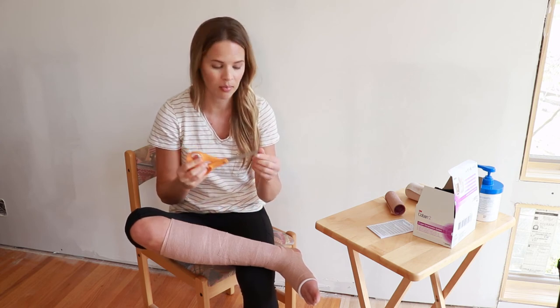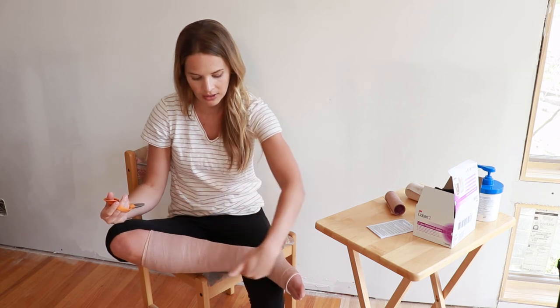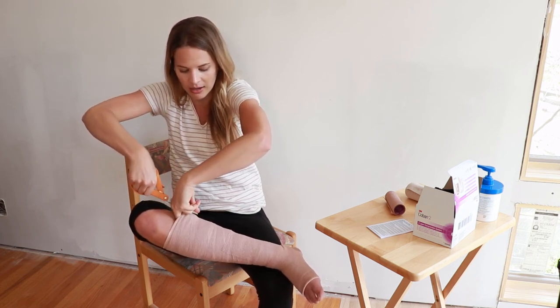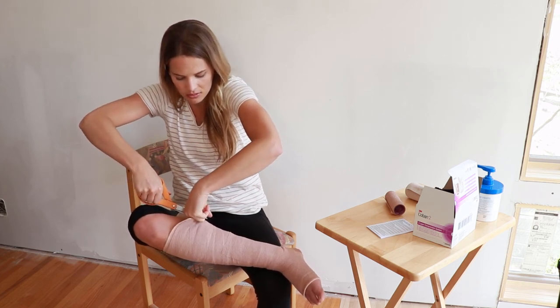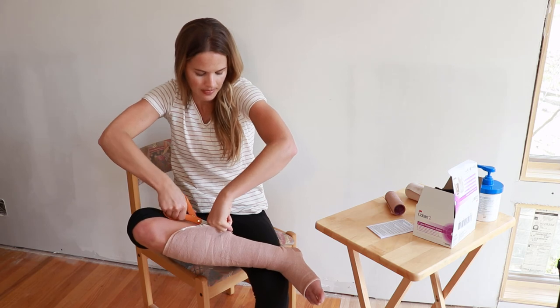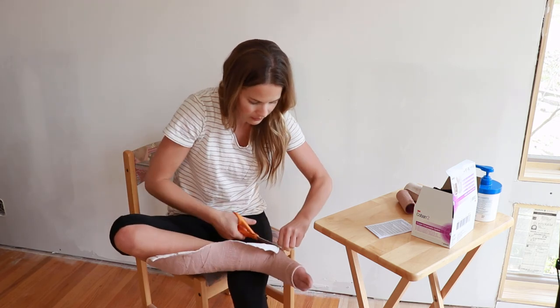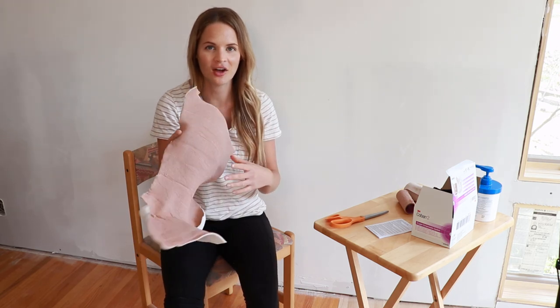You want to use blunt tip scissors so you don't get yourself cut. Cut on the side of the leg, not down the middle, so when you come down with your scissors you don't get yourself. Stick your fingers underneath and put the scissors on the other side so you don't cut your leg — you'd rather feel it on your hand. If you did a lot of layering it's going to be a little bit thicker so you might have to do it in sections. Cut all the way down. And there it is — all cut off, just throw it away when you're done.